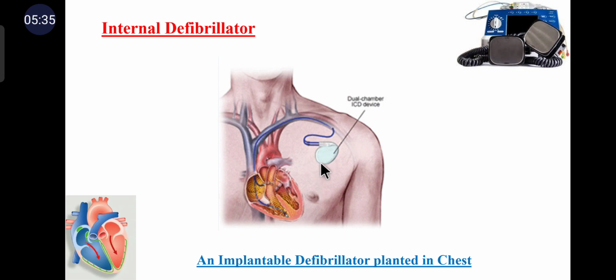A modern implantable defibrillator is an implanted computer which records the patient's heart signals and collects extensive therapy history and diagnostic data files to aid the physician in individualizing device behavior for each patient. Less than 70 ccs in volume and with over 30 million transistors, these implantable devices draw less than 20 microamps during the years of constant monitoring of the patient's cardiac status. So this is a small piece of information regarding the implantable defibrillator.